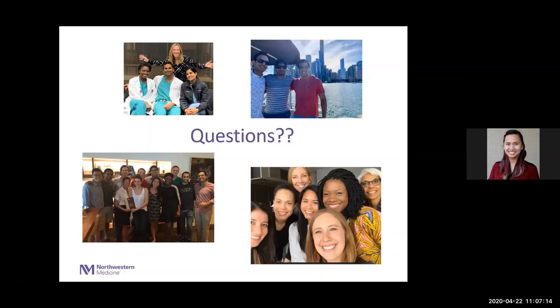So it depends if we're talking about men and women. What you want to look at is their detrusor pressure at peak flow. That tends to be the most accurate. For men, we discussed what the voiding pressures were. There's not a true number where you say, oh, this patient definitely has to have an outlet procedure. Really what you're doing with the urodynamics is saying, okay, they have a high voiding pressure, we're going to treat that outlet resistance.